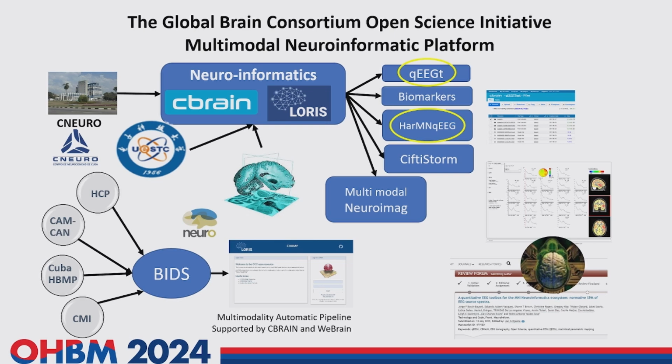So our purpose is that we will be collecting in this platform freely all the tools that we have been developing during the years for the EEG analysis.